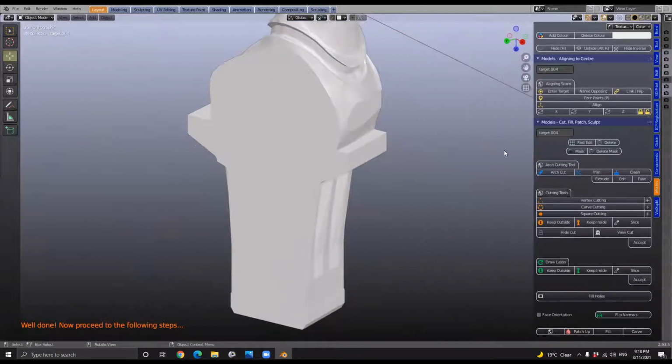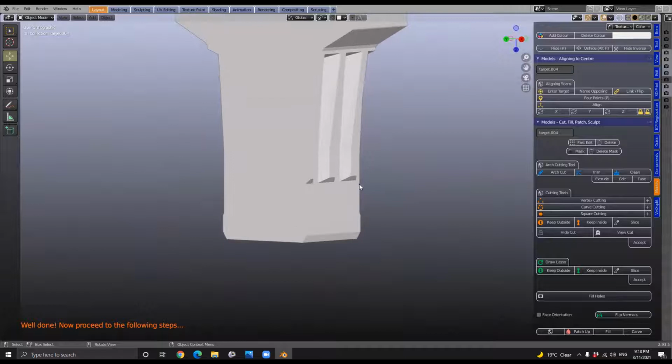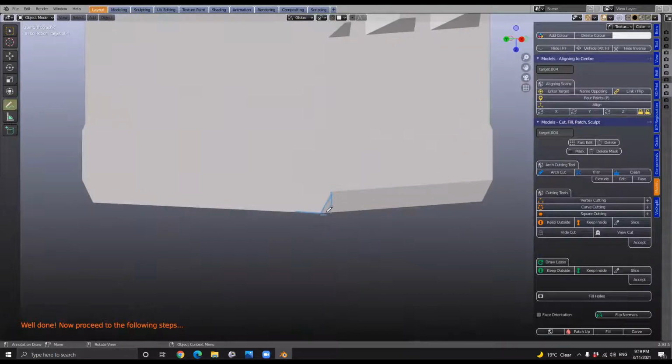Yeah, so that's exactly, Wolfgang, you've actually jumped quite a few steps ahead with the burn layer. But to diagrammatically show how this works, I'm just going to make a little bit of a diagram. So this step, what you're saying is, now you've got an angle here, right? Yes. Okay, so you've made the step so that this step is a certain distance. It is 0.8 millimeters, which means if you're printing 100 microns, by all means set the burn layer to 8 layers of 100 microns. Of course, we know that the first burn layers will be, I don't know, 30 or whatever seconds. So that causes that swelling. If you're printing finer at 50, then just adjust that accordingly. But keep in mind, we've got that set to 0.8 millimeters.